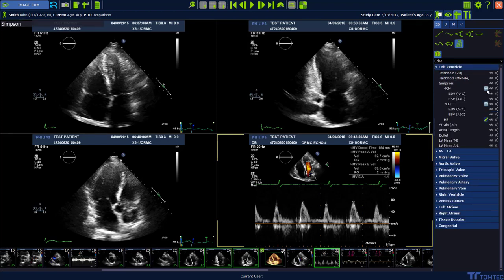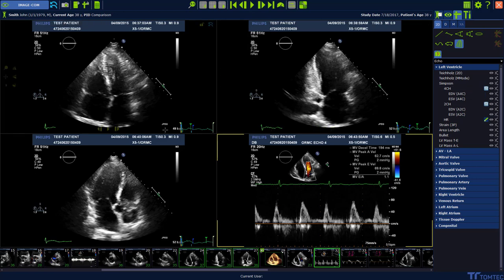Here you see already the automatic detection button, but before we start the analysis we have to check our images. They should be in the right orientation — the standard orientation. If they are not in the standard orientation, please use the flip and rotate buttons in the smart regions to adjust the image orientation.